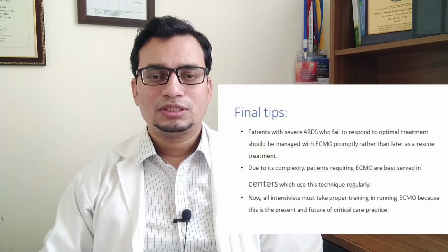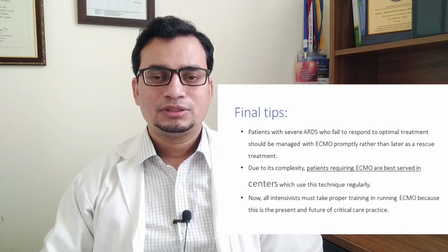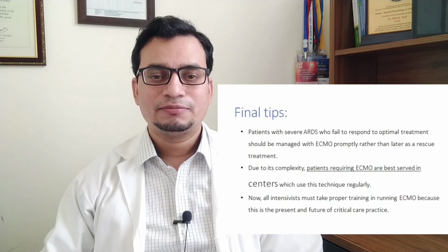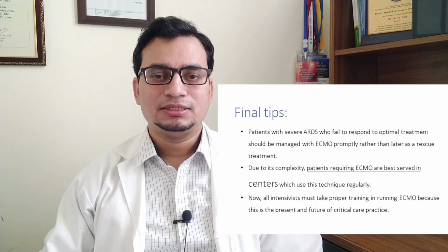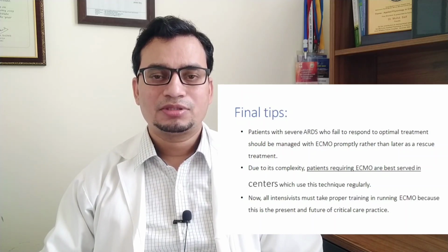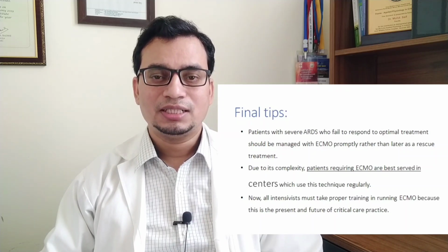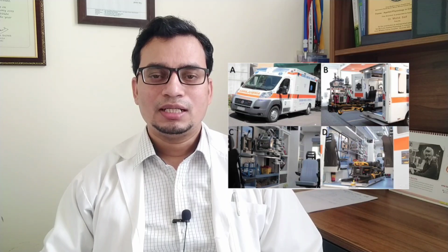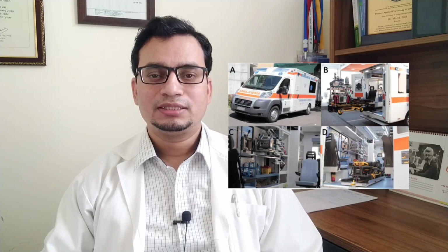Now, the main points you must remember about ECMO. Patients with severe ARDS who fail to respond to the optimal treatment should be managed with ECMO promptly rather than later as a rescue treatment. Due to its complexity, the patients requiring ECMO are best cared for in the centers which use this technique regularly. So there should be ECMO centers installed in each city, okay, and the patient should be referred to the dedicated ECMO center for better efficacy.